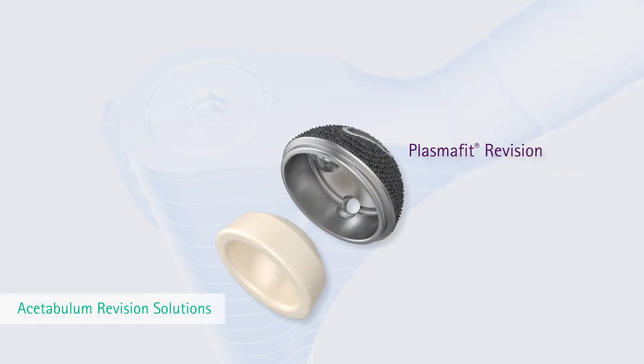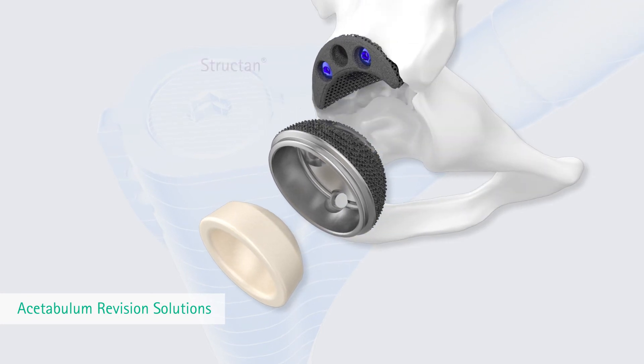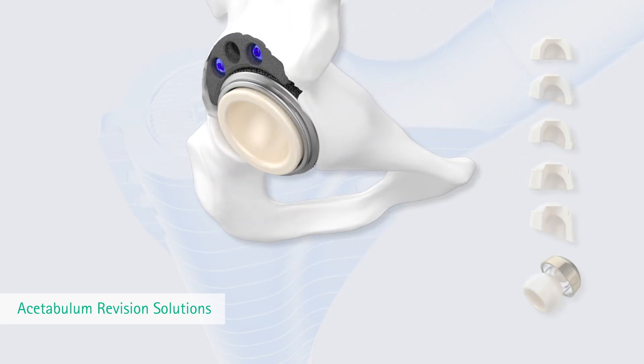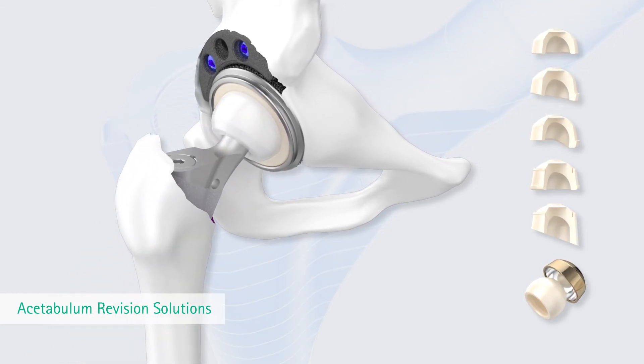Esculap also offers a revision solution for the acetabulum. The PlasmaFit revision cup has joined the PlasmaFit family and continues the system concept. Various Vitaline options are available, including special revision liners.